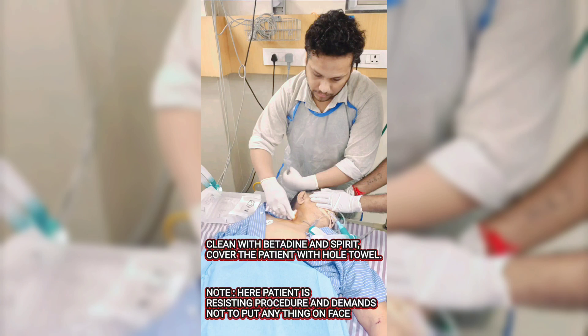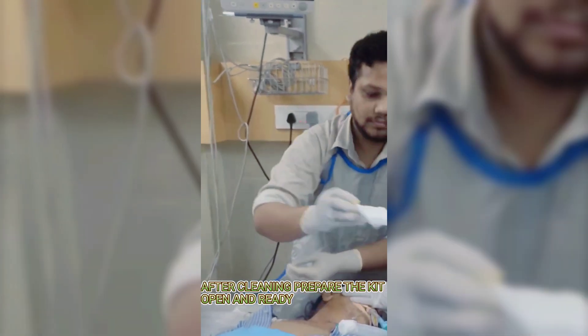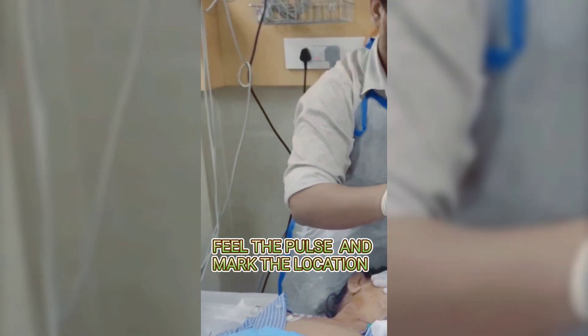Clean the site with betadine and spirit, then cover the patient with a full draping towel. Note: this patient was resisting the procedure and demanded not to have anything placed on their face. After cleaning, prepare the kit — open and ready.